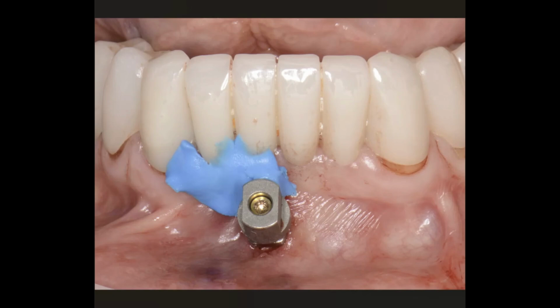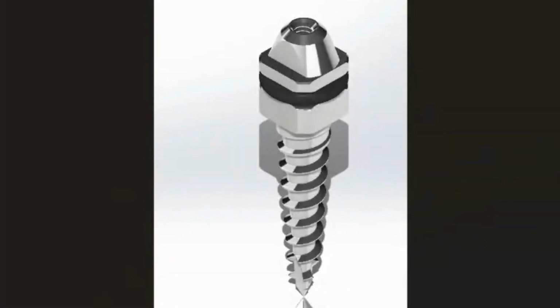Absolutely. We put a multi-unit abutment on the bone screw, and then you're able to put anything on the screw that you can place on a multi-unit abutment. So any cataloged scan body that is available for a multi-unit, you can put on there. So then, Keith and I have no interest in manufacturing and building stuff and undertaking that. So we went to our friend Danny Domingue, and Danny said, "I'll be glad, I'll be happy, I'll be glad to produce this for you guys." So Danny manufactured for us the bone screw that goes in the chin and a multi-unit abutment.